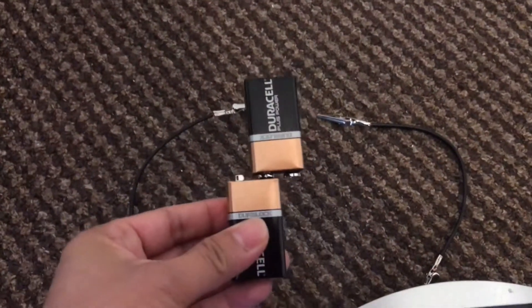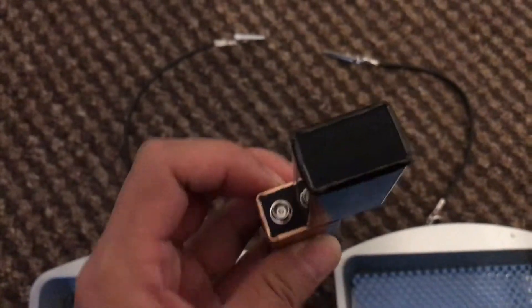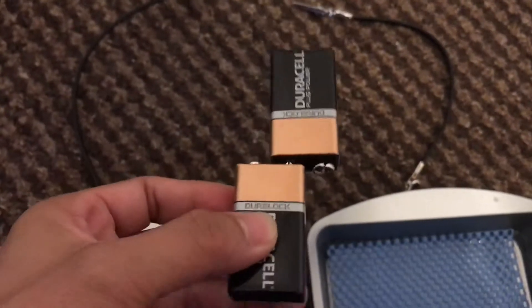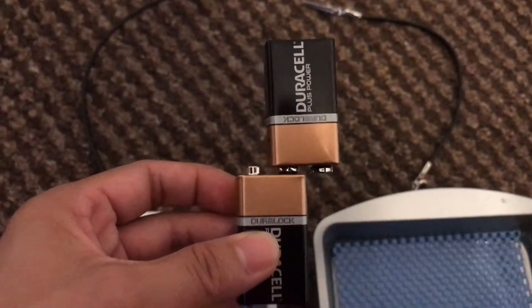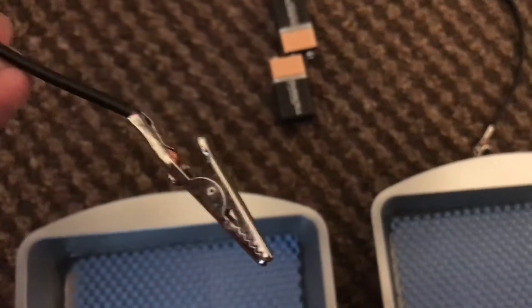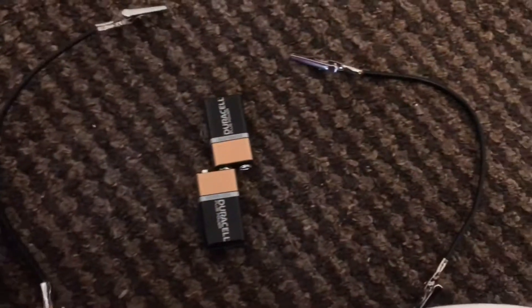So you need a 9-volt battery. You have to connect it for the positive and negative — you can see it's connected already. And alligator clips, which are going to connect. So these are all handmade.